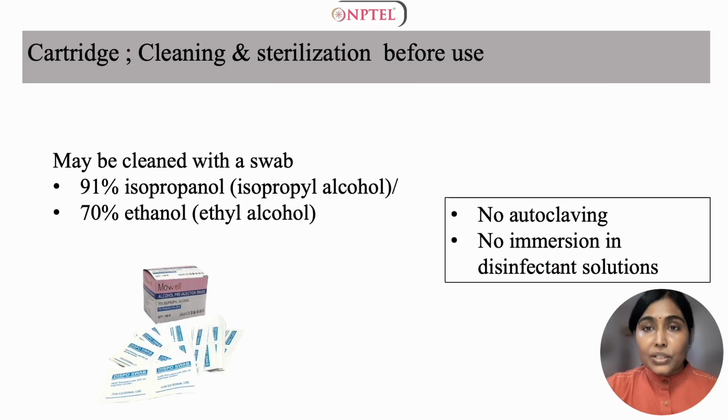Cartridges are packaged inside pre-cut individual blisters, which protects them from cross-contamination. It is not necessary to take additional steps to clean the cartridge prior to use. They are considered clean as they come from a container, so you don't have to autoclave, because this may damage the cartridge components and also cause the epinephrine to degrade, as it is a thermolabile substance.